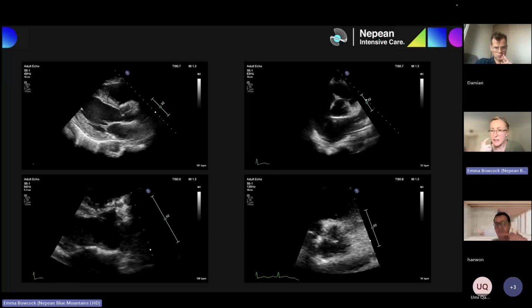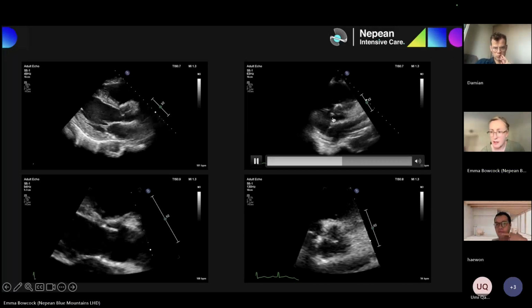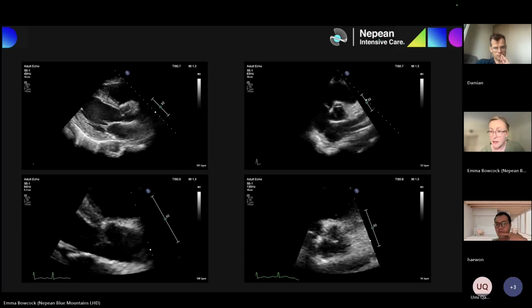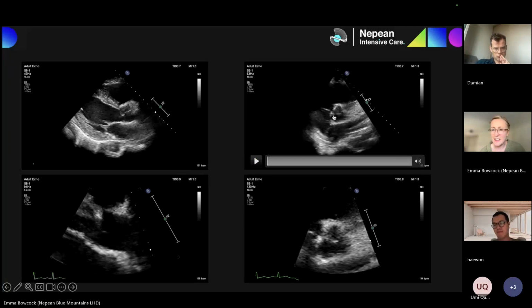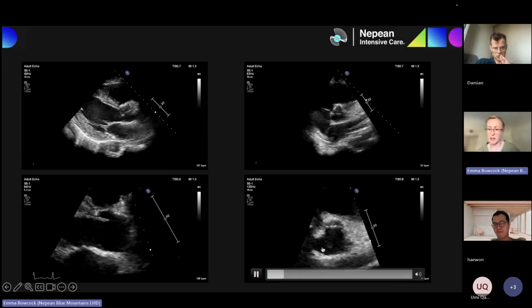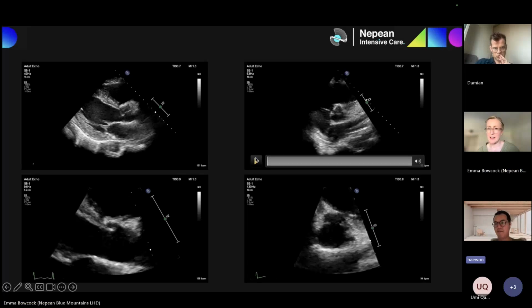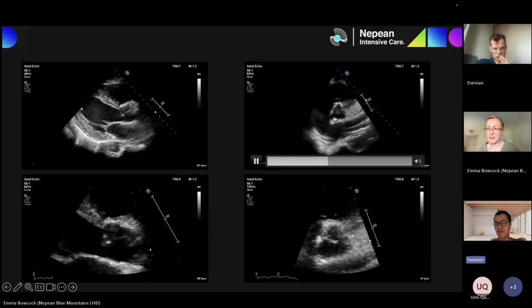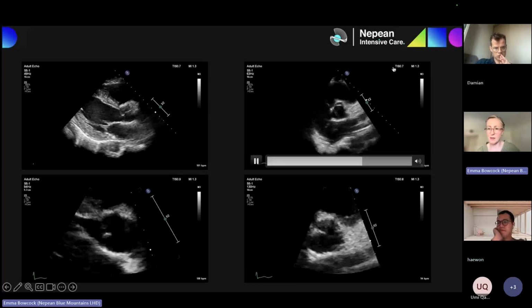This is short axis at the level of the aortic valve. Just put it here. Right and non. What's the consensus? This one here. Maybe I'll come to the zoomed view and I'll put it here. It's a non-coronary cusp next to the interatrial septum. Perfect, lovely, and that's how you orientate yourself, right? So that's really nice here.